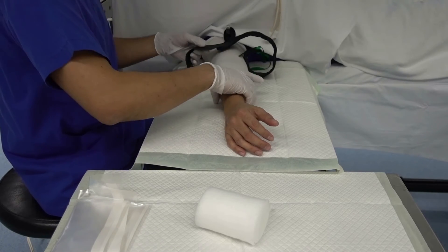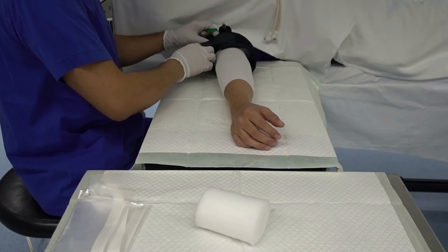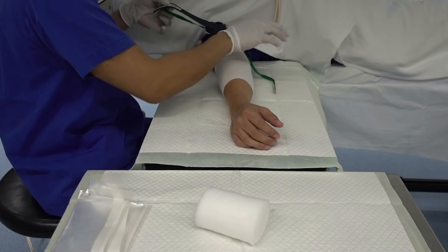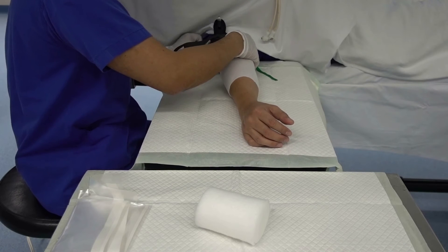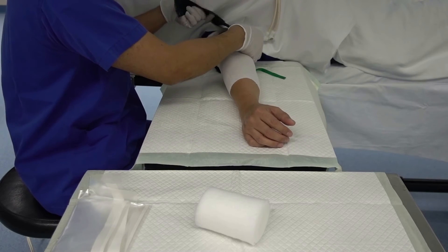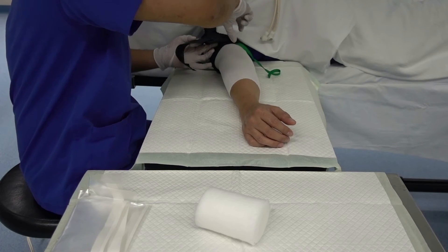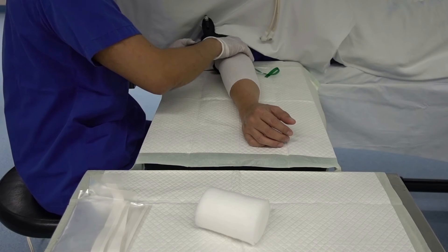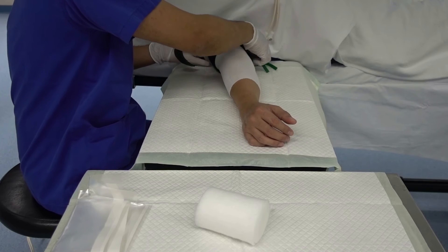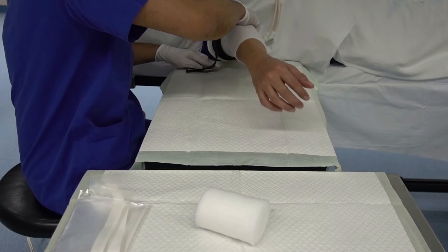Now let's apply the appropriate size bladder cuff on the arm of the patient. The cuff should overlap at least three inches but not more than six inches. Too much overlap causes rolling or wrinkling of underlying soft tissue, which increases pressure to the areas of overlap. Make sure the Velcro straps are effectively fastened and both ties are knotted together.